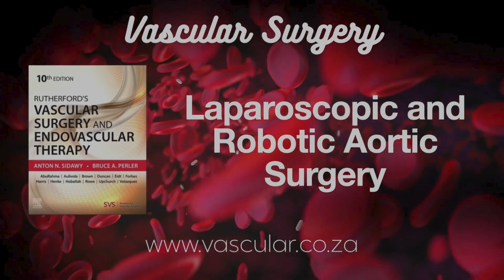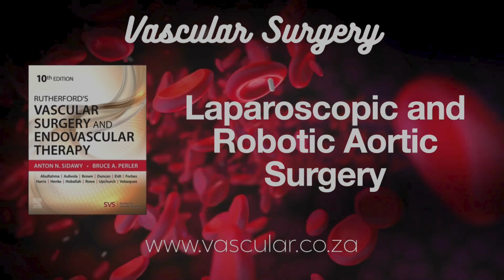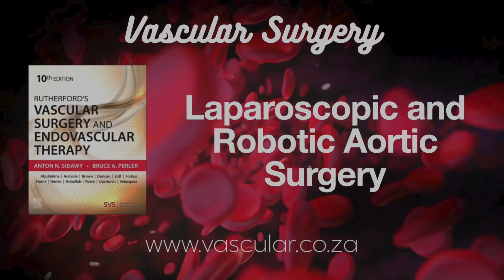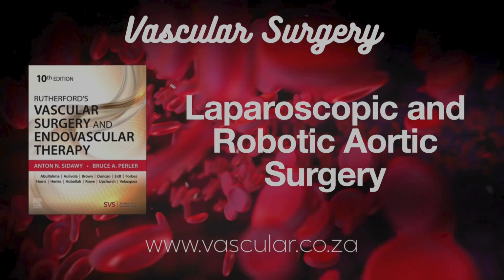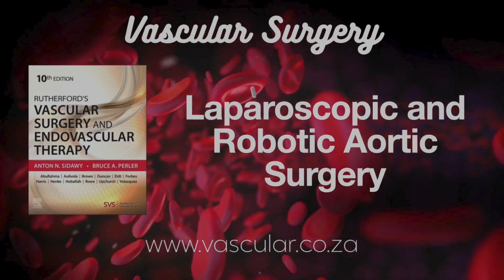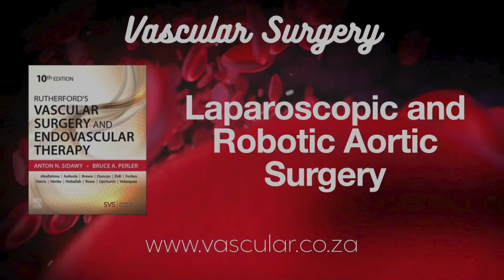Yeah. How's the patient set up for a fully robotic case? Positioning is, well, it's similar to TLAS, but maybe more extreme. Often a steeper table tilt, maybe 45 degrees. Sometimes special pillows like the pelvic tilt pillow. To get gravity to help even more. Exactly. Optimize the view and access. And the trocar placement, the ports for the robot arms, is super critical. Why's that? Because the arms need space to move without clashing.